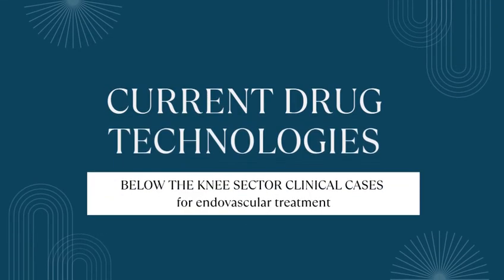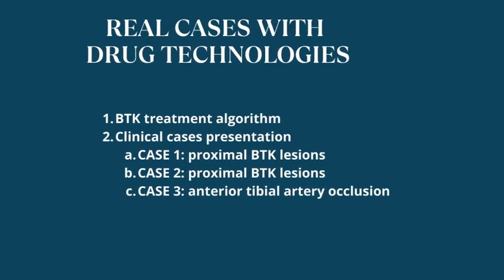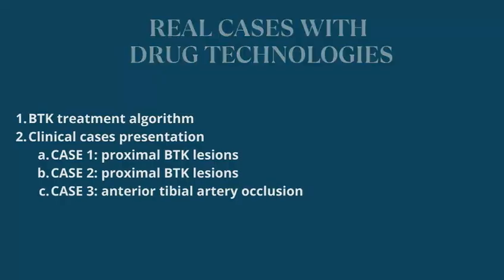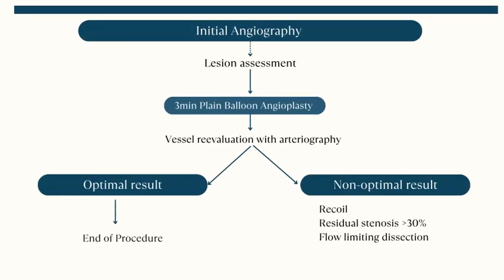Current drug technologies in the below-the-knee sector, illustrated with various clinical cases. The proposed algorithm for treating this sector begins with an arteriography. The first step in treating these lesions, whether stenotic or occlusive, is performing a simple angioplasty for 3 minutes.